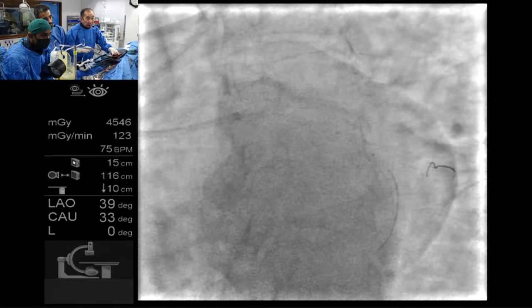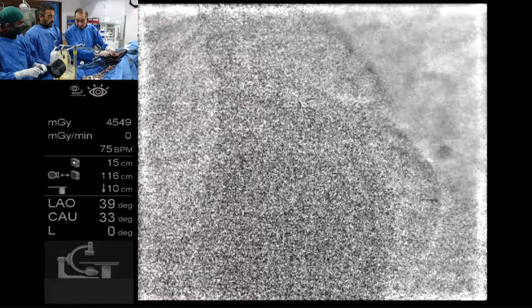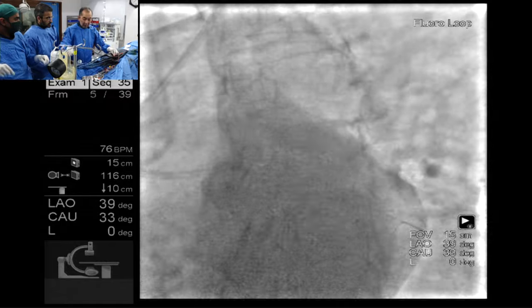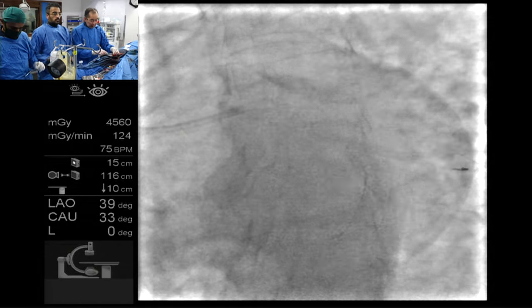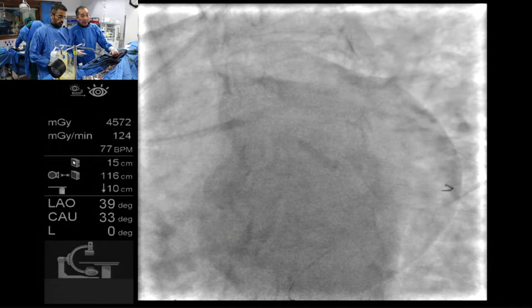Okay, good. We had a 3-5 balloon. Hold on, don't move. We had the 3-5, right? This is a 3-0, right? The main branch, 3-0 balloon. Okay, give me a 3-5 balloon. Let me do a part. Inflate this one first. Okay, go. Go here. Fill high. 18. Give me the 3-5 balloon.